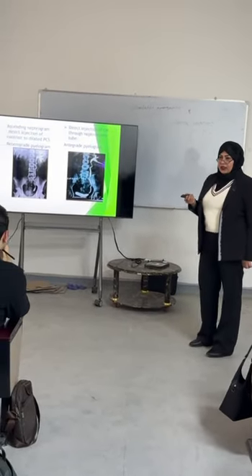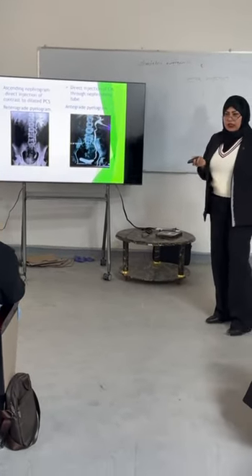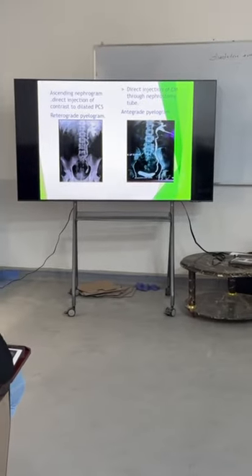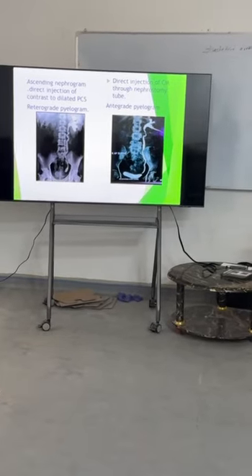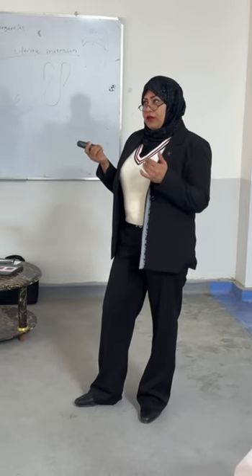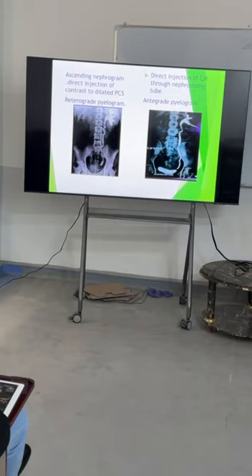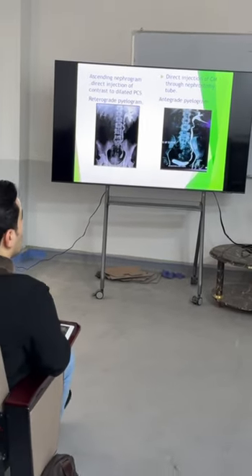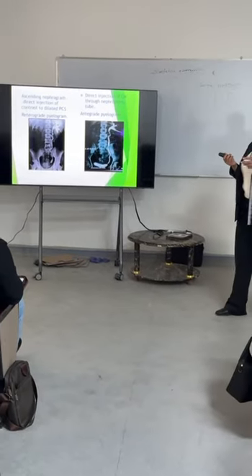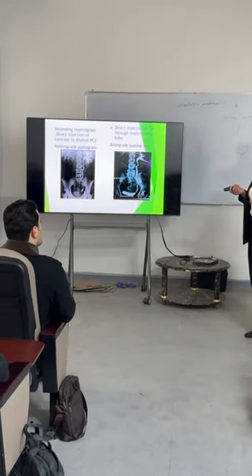My question is, why do you use this type of contrast study? For what do we use it? It should be different. Why do we use it? The main indication is when the IVU is not informative.